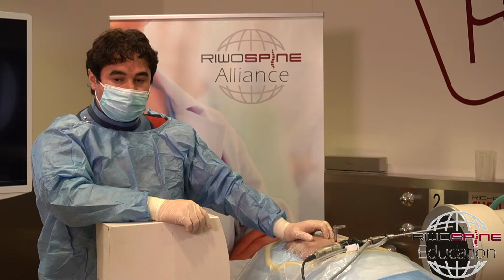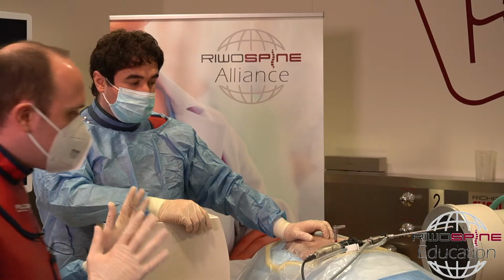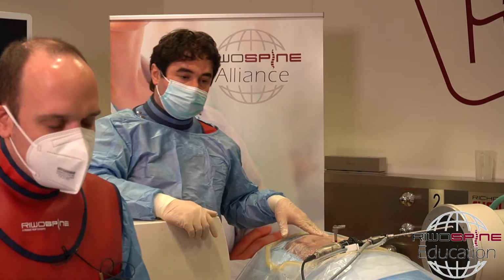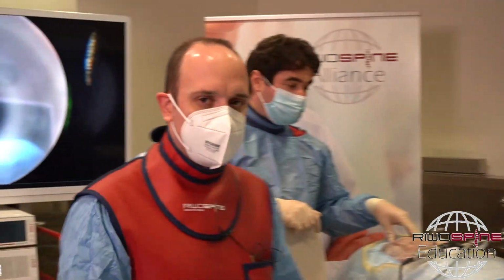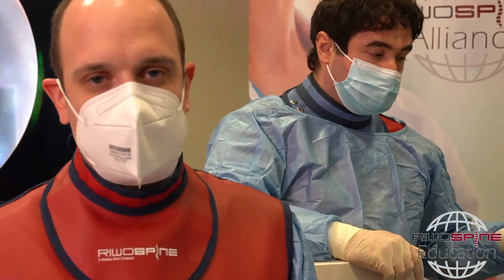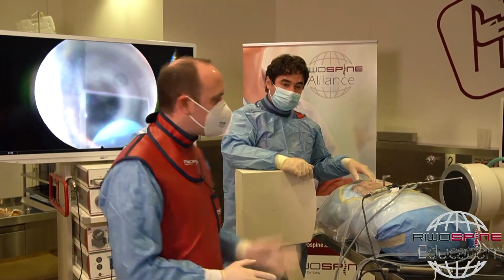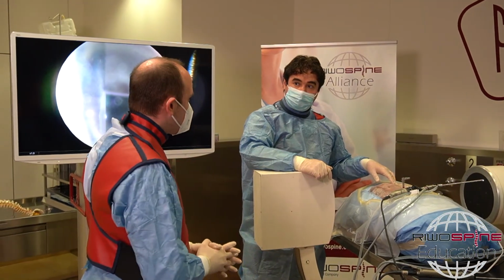And the second question is if we can introduce several instruments into the endoscope. Most of our instruments take most of the volume inside the endoscope, which means that you can only use one tool at a time. Then the third question that we have, Dr. Yarkoglu, maybe you can answer that one.